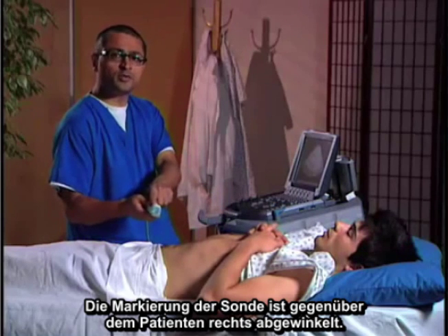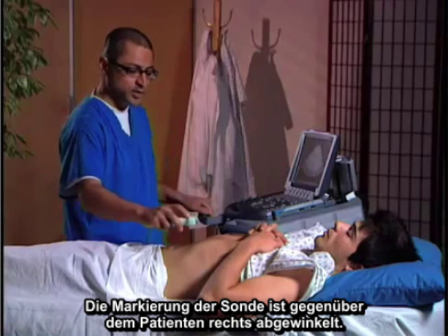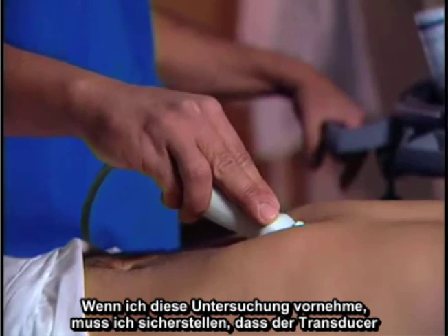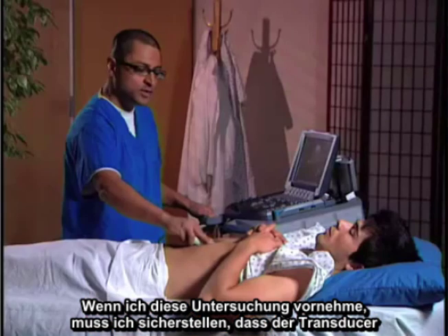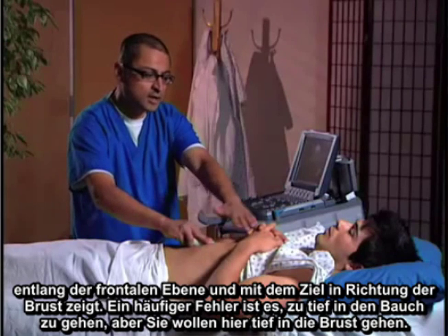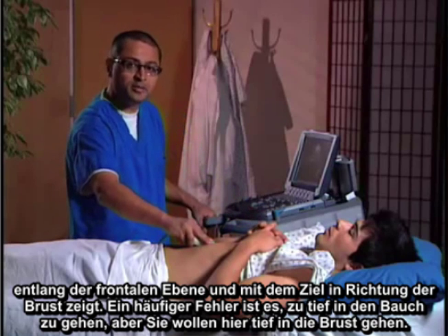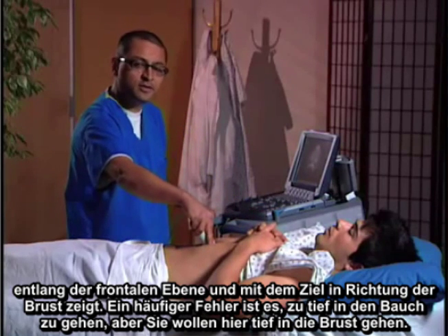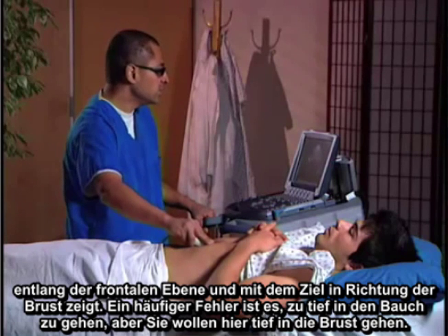Here is the probe marker, which I'm going to angle toward the patient's right. When doing this exam, I want to make sure the transducer is along the frontal plane and aiming toward the chest. A common mistake is to go too inferior into the abdomen, so you want to aim deep into the chest.